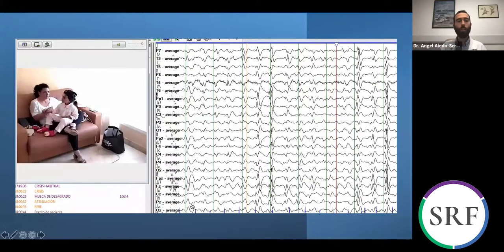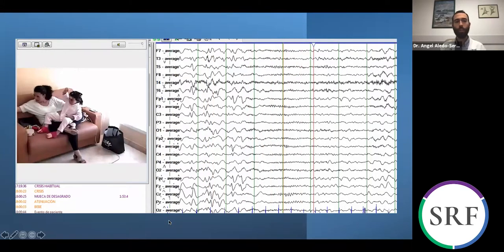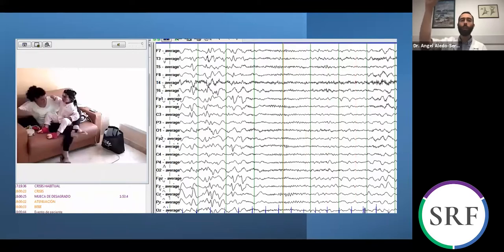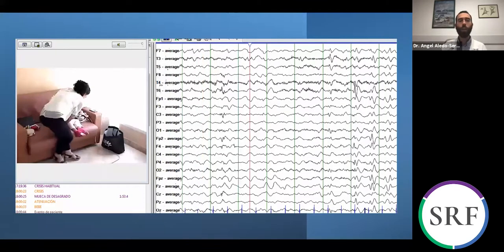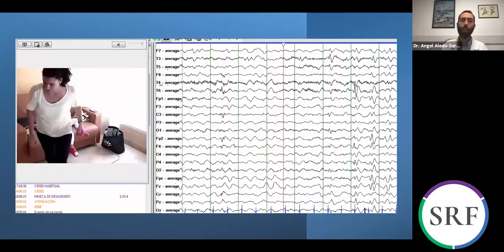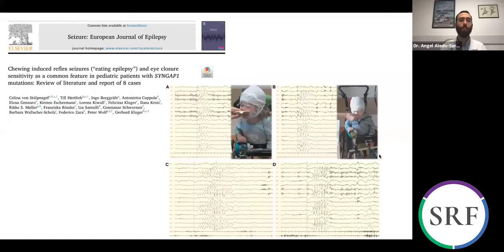Here is another Syngap 1 patient. You can see that during drinking or during chewing, a seizure can occur — this is a tonic seizure triggered by drinking. This is something described typically in Syngap 1: eating epilepsy. Sometimes it's also drinking epilepsy. We see seizures provoked by these activities.